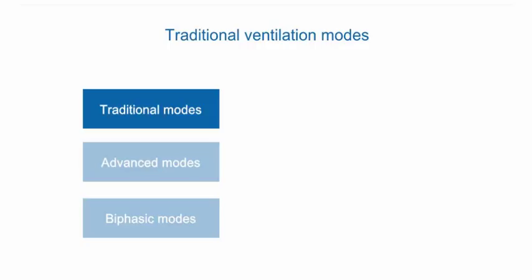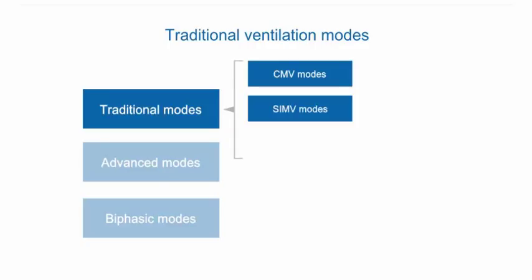modes in 3 groups. Continuous mandatory ventilation modes, CMV modes. Synchronized intermittent mandatory ventilation modes, SIMV modes. Support modes.